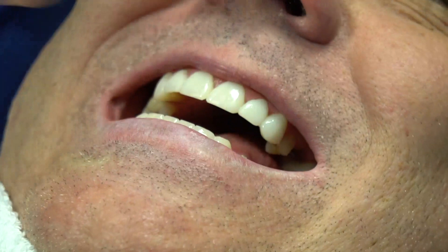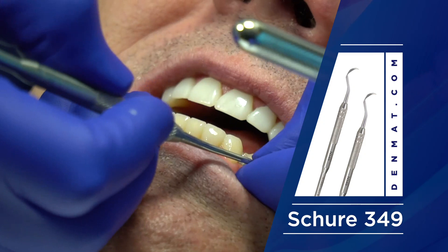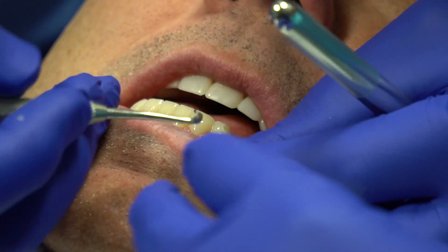So these are our attempts. This is a Shure instrument — Denmat sells them. I'll start with the lowers because I'm going to go down at the gum line and try to hook with a scaler. You can see how that's starting to pop up, and if I can just unseat these from the gum line.